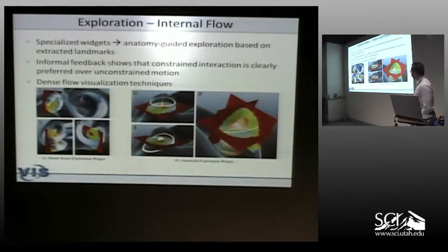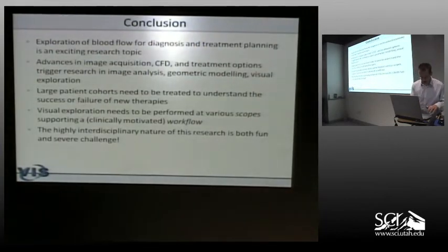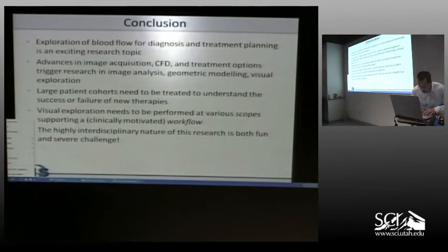We employed widgets which can be moved along the plane to probe the plane, and these widgets are guided, like in virtual endoscopy, by the center line of the parent vessel and also by this axis from the parent vessel to the dome point in the aneurysm. So I should show the final video.